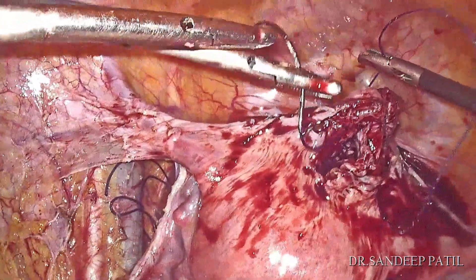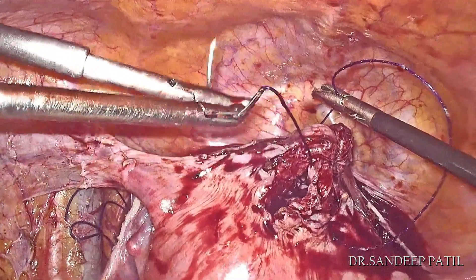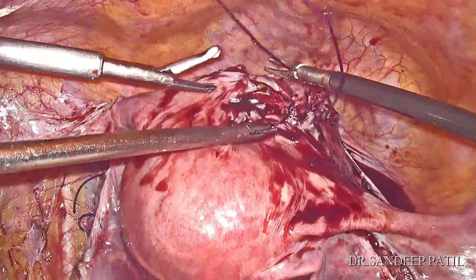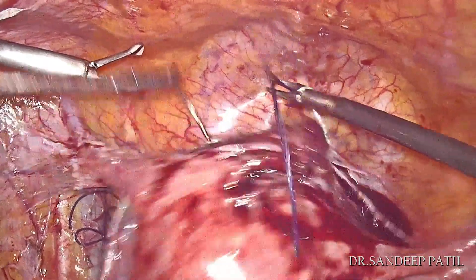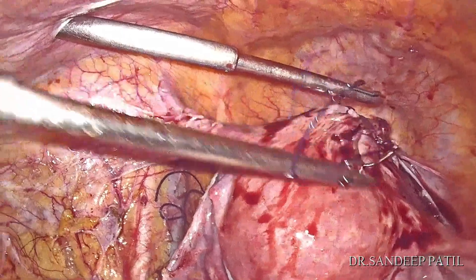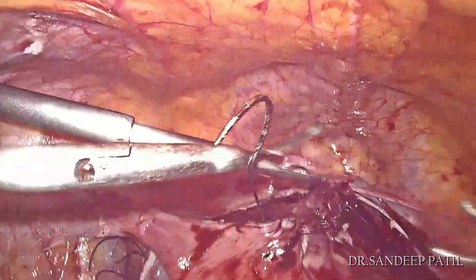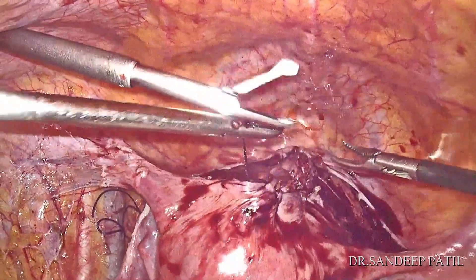Consistent tension along the suture line can decrease the likelihood of tissue necrosis, tissue dehiscence, and hematoma formation. The reduction in operative time and potentially lower complication rates are the key factors which balance the additional cost. One can see the suturing of the myoma bed is beautifully done by V-lock sutures.